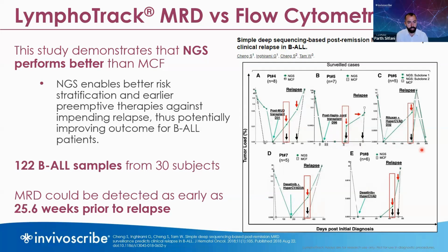Now, the real challenge with those samples is actually amplification. As you know, for sequencing, we have to have a certain amount of DNA before we can load it onto the sequencer. And using a multiplex PCR, if there's very little polyclonal background or clonal background, if there are very few lymphoid cells present, then we have difficulty amplifying any rearrangements to detect. So you get a very low read count, but you can still test those for the presence of the clone that you're tracking.